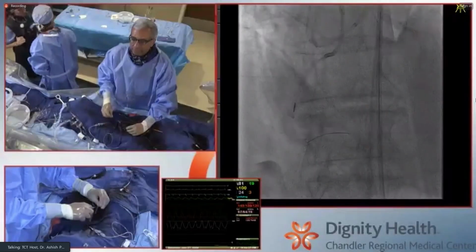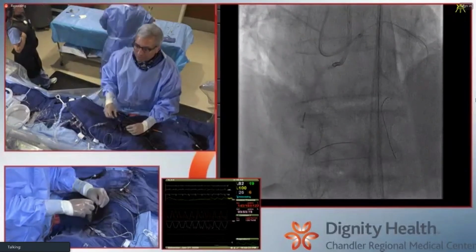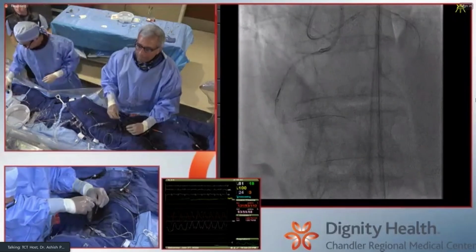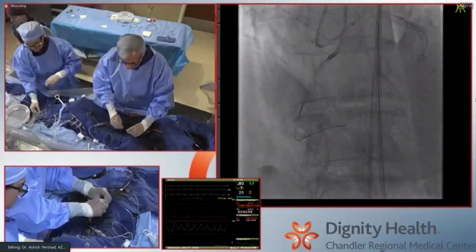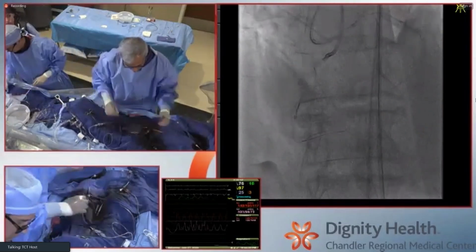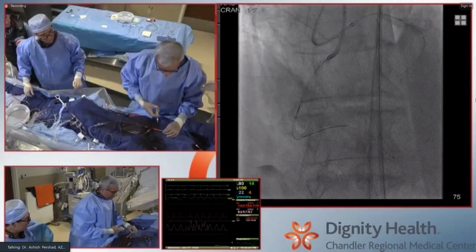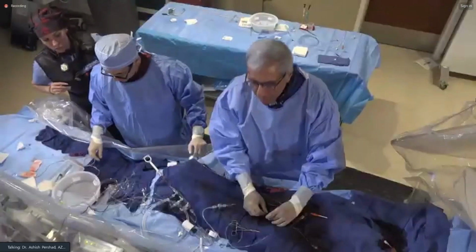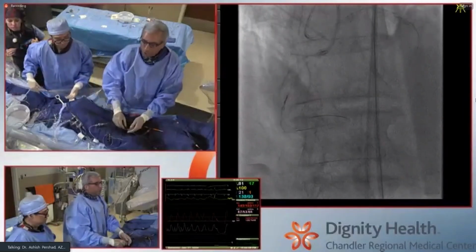The other nice thing is, Ashish, as you put your externalization wire through, you're going to put that out. What's your process at this point to get your wire out? Do you disconnect the Y and put the wire through? I just clamp it proximally and then, yeah. Go ahead. Arun Kalyanasundaram is joining us as well. Ashish, Arun says hi. Oh, hey, Special K, how are you doing?